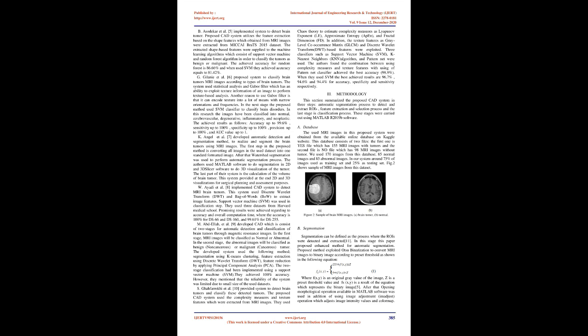In the next stage, the proposed method used an SVM classifier to classify brain disorders. In this research, the images have been classified into normal, cerebrovascular, degenerative, inflammatory, and neoplastic. The achieved results are as follows: accuracy up to 99.6%, sensitivity up to 100%, specificity up to 100%, precision up to 100%, and AUC value up to 1.